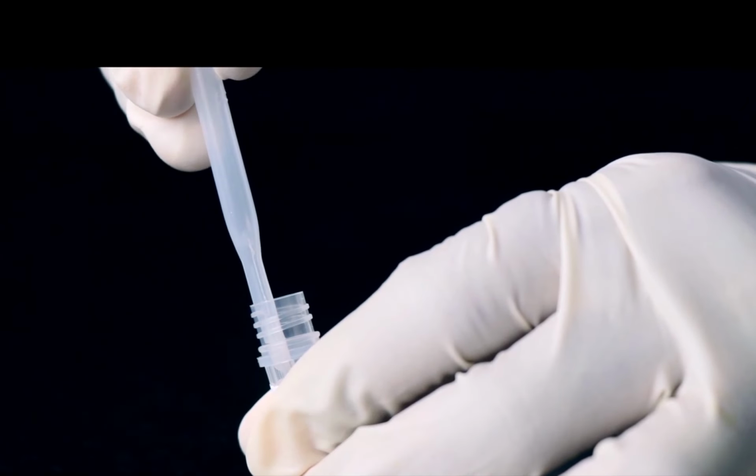So once this process is over, your DNA is extracted, you have put it in a tube. Say now you could only do this much. Now you have your shift has ended. There is no issue. Now this tube you store in freezer compartment, okay, of your refrigerator. All the other things which I was telling, liquefaction buffer and the chips store in normal fridge compartment lower. But this particular thing, if you want to do the next day, store it in the freezer compartment. Okay, so this has to be freezed. This has to be stored at a much lower degree. And next day you can keep it out and you can freeze thaw it. You thaw the whole thing, then you can do the test.